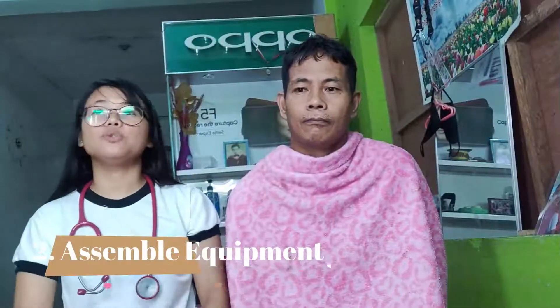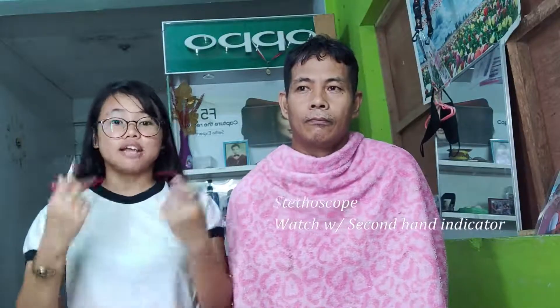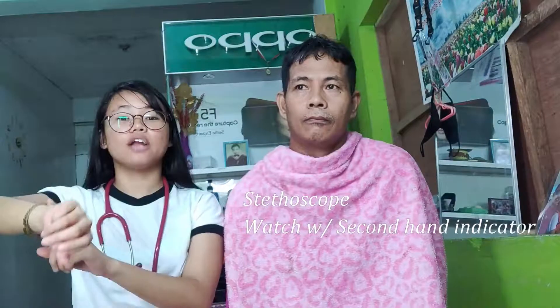Next, you need to assemble the equipment needed. The equipment needed are the stethoscope and a second-hand watch indicator.